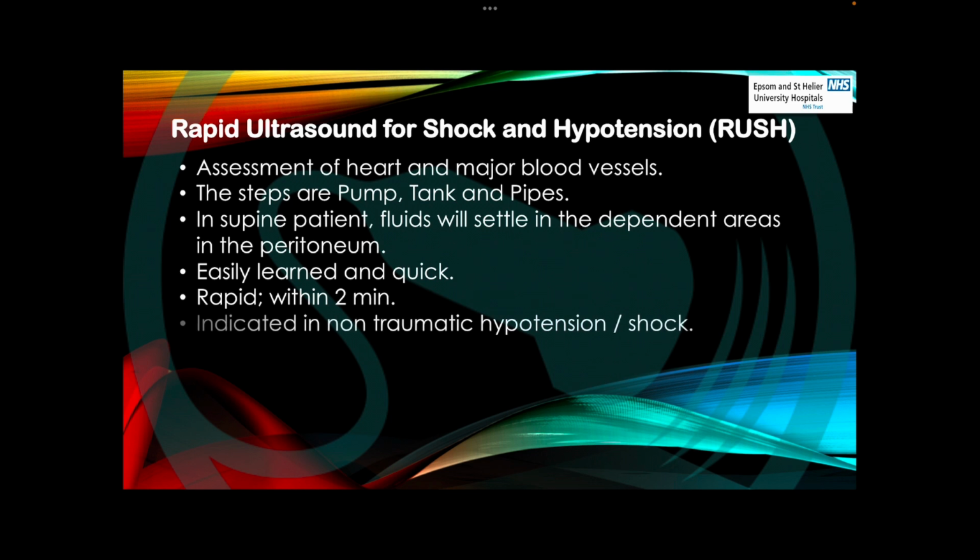It is indicated in non-traumatic hypotension or shock, either hypovolemic, obstructive, cardiogenic, or distributive. These are the indications for this type of protocol. And also we have to keep in mind that there is no absolute contraindication for this protocol.